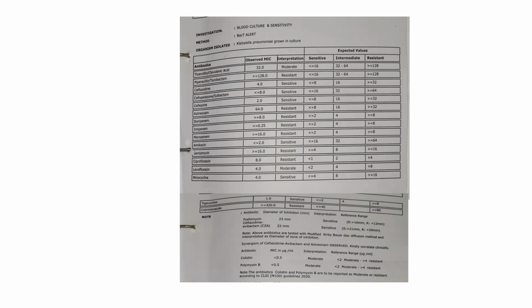And you can see there is colistin or polymyxin mentioned here. Here the colistin and polymyxin MIC is done with the use of E-strips. The way to obtain the MIC is either you use an automated machine or you use E-strips. E-strips can give you the exact MIC. Disk diffusion cannot give you the MICs. It can give you the zone of inhibition, or the diameter of the inhibition.